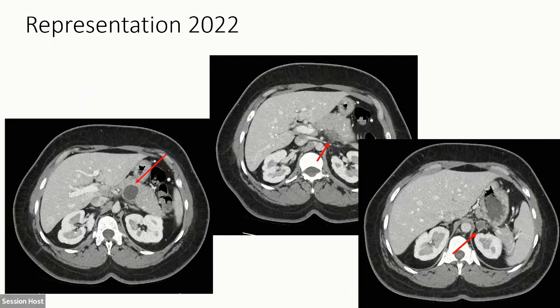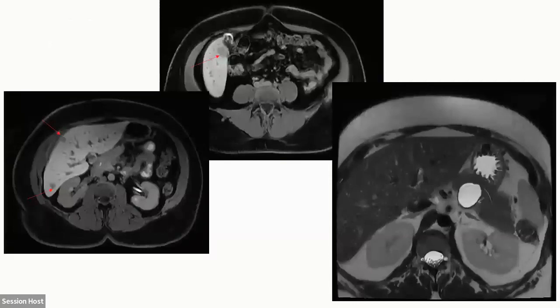So what was concerning about it, though, was that now the patient's splenic vein was actually out. So it was out at the area distal to this lesion here. Plus, there was an area kind of at the top portion of this lesion that was a little more concerning. And I wasn't sure if it was just some pancreatitis changes associated with the cyst itself, or was it something else? Was it something more solid? So she went and got an EUS as well.